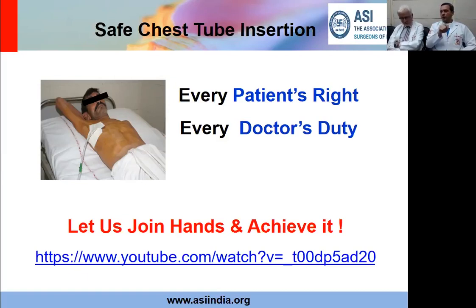No matter how much local you give, when you put a finger and do this maneuver, it causes more pain. When you have pneumothorax and lung collapse, or when you have hydrothorax or hemothorax and the lung collapses, then the lung is actually away from your chest wall. So the possibility of your tube injuring the lung is remote.